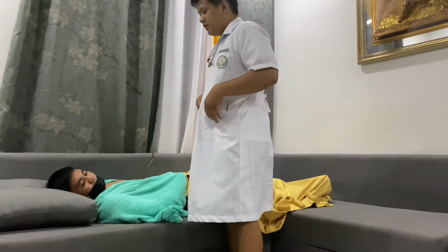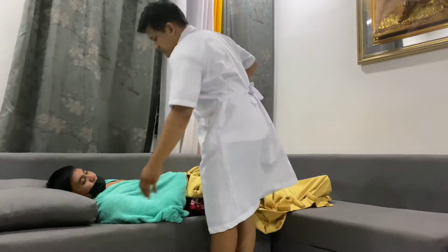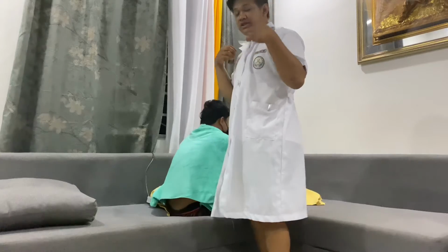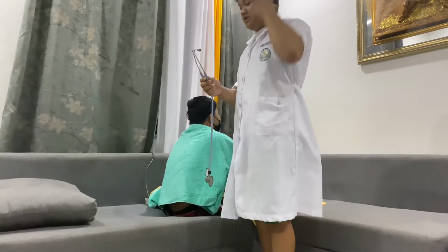So next, I am going to auscultate his carotid artery in sitting position. So sit here, sir. Now I'm going to use this stethoscope to auscultate his carotid artery.